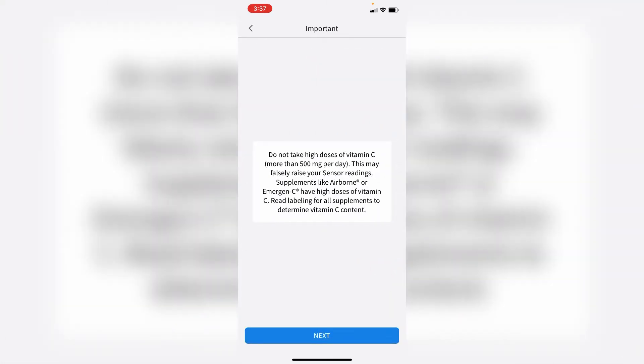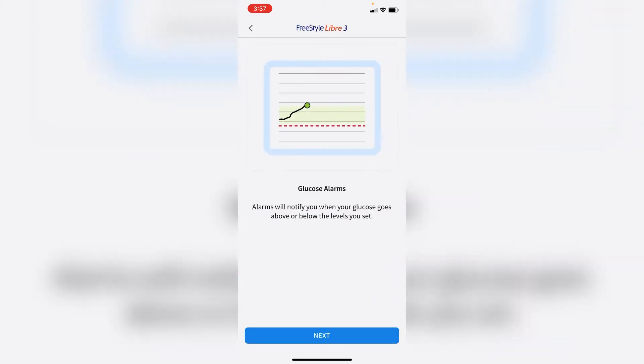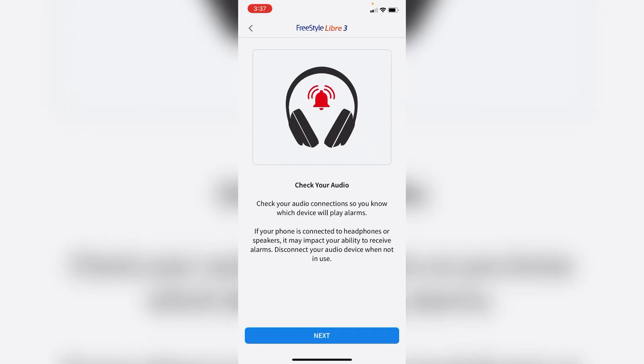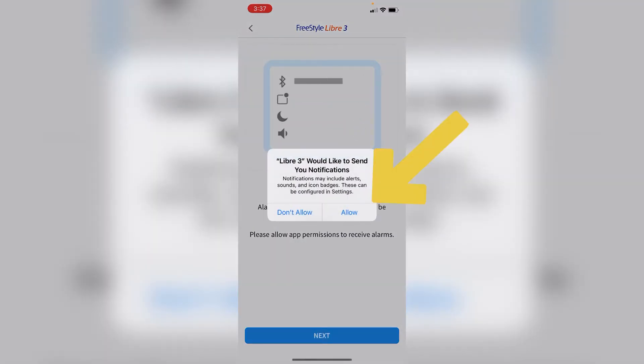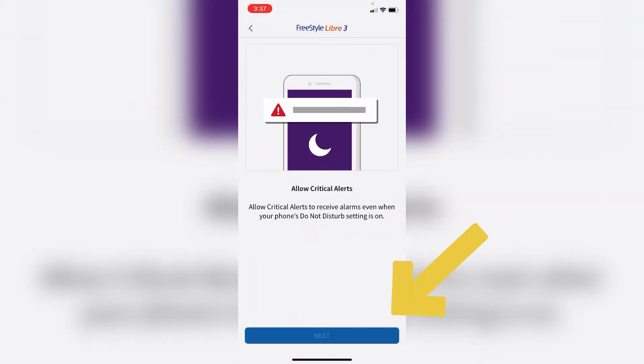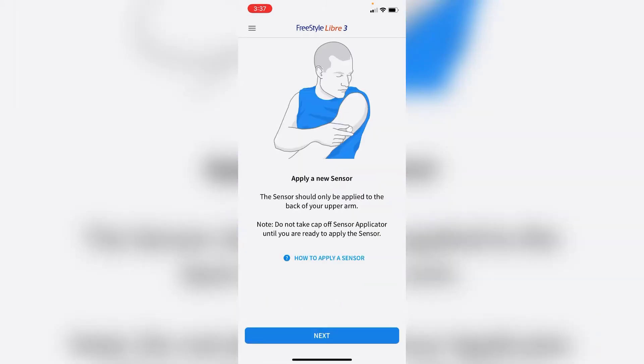The app also shows you how to do a finger stick — you probably know that, so just click next. It then covers how the graphs work and the alarms. You do have to set up the alarms so they will sound. Click allow, and that simply enables the alarms. Now we're ready.